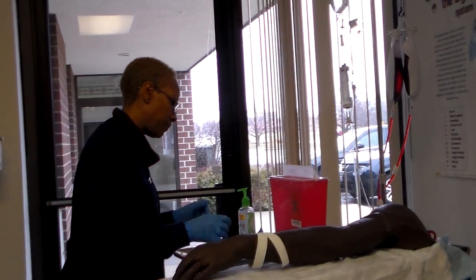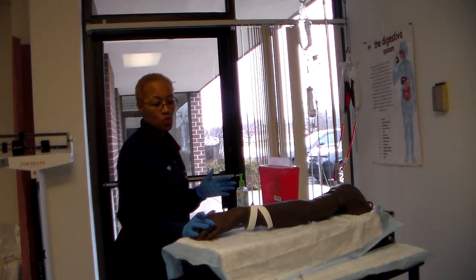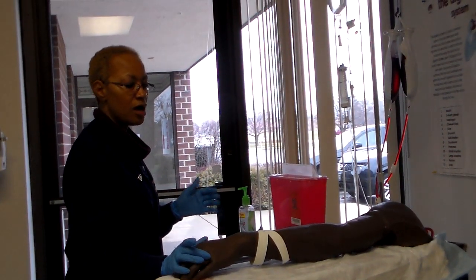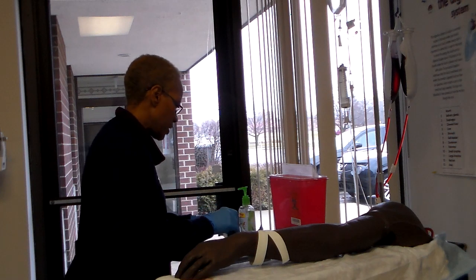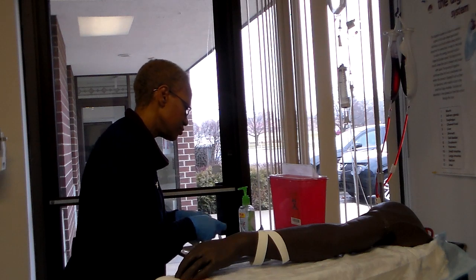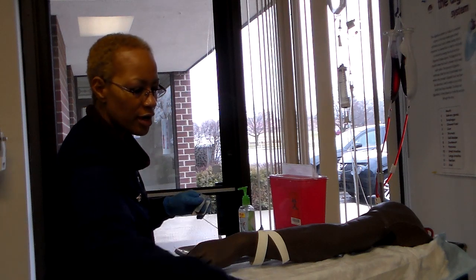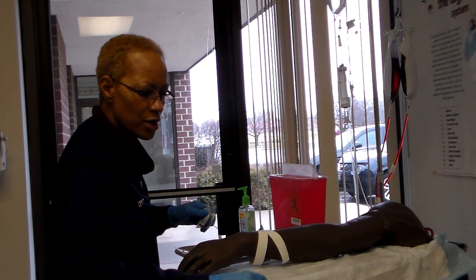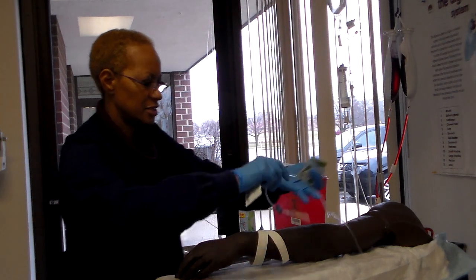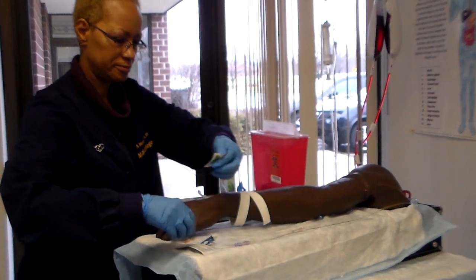Let it relax a little bit. Okay, and if you want, you could provide a local anesthetic at this time. Okay. And now we're ready to clean our site. Now make sure that your IV tubing is nice and close to you, because you'll be ready to insert it once you get your IV in. Let's see if I can put it up here if it won't fall. Okay, good. That's good. Stay.